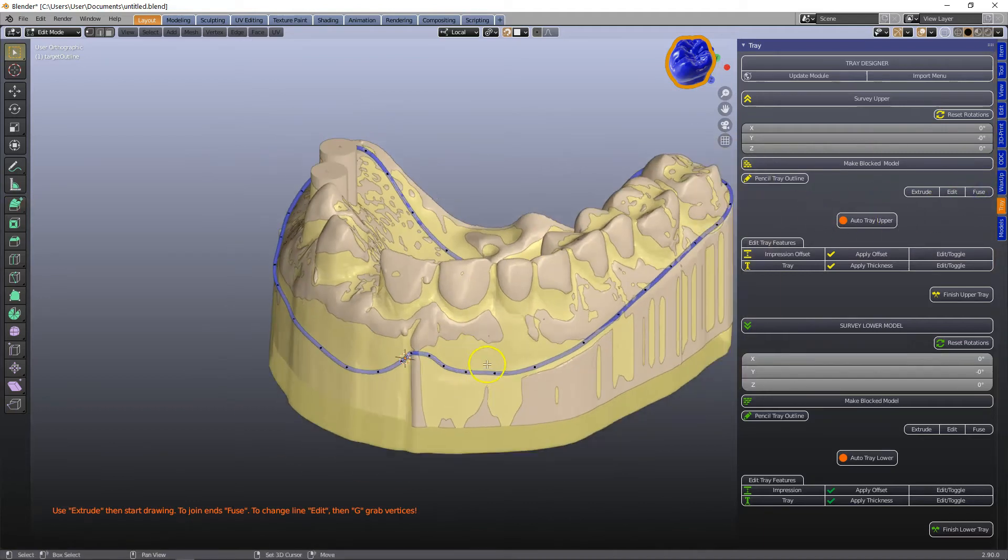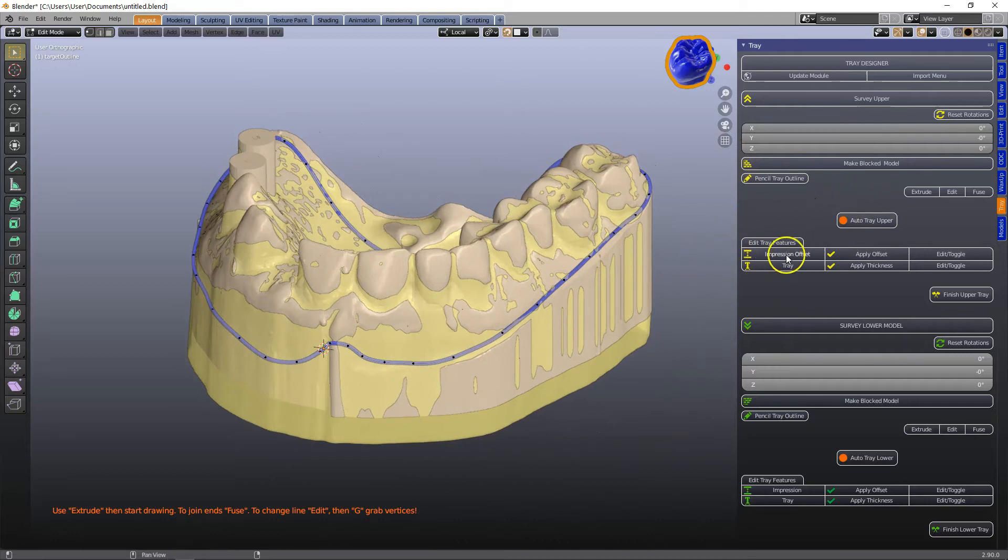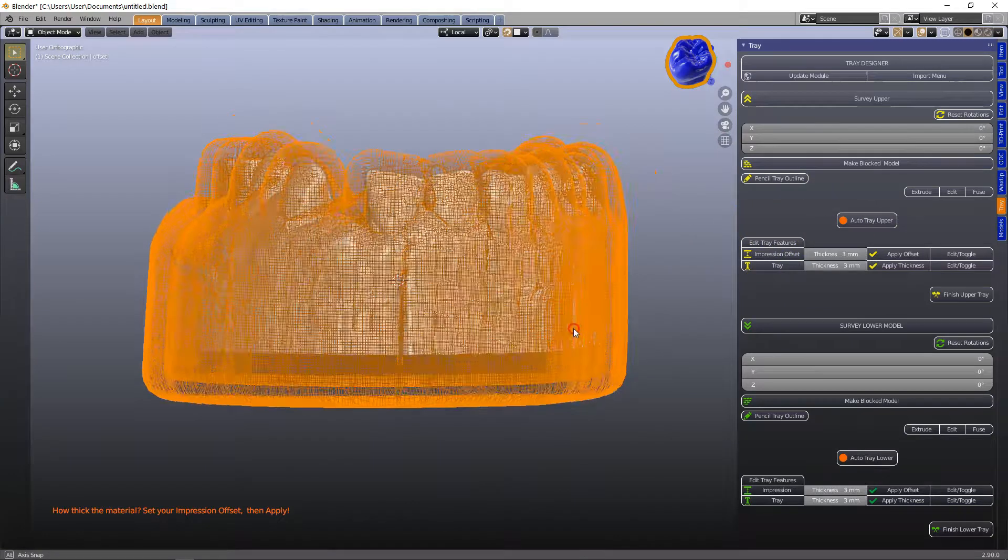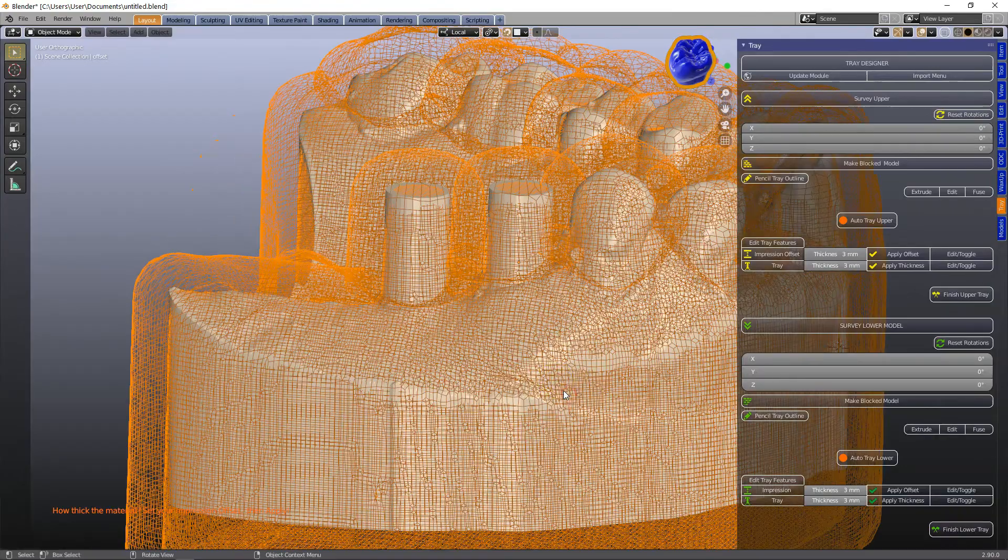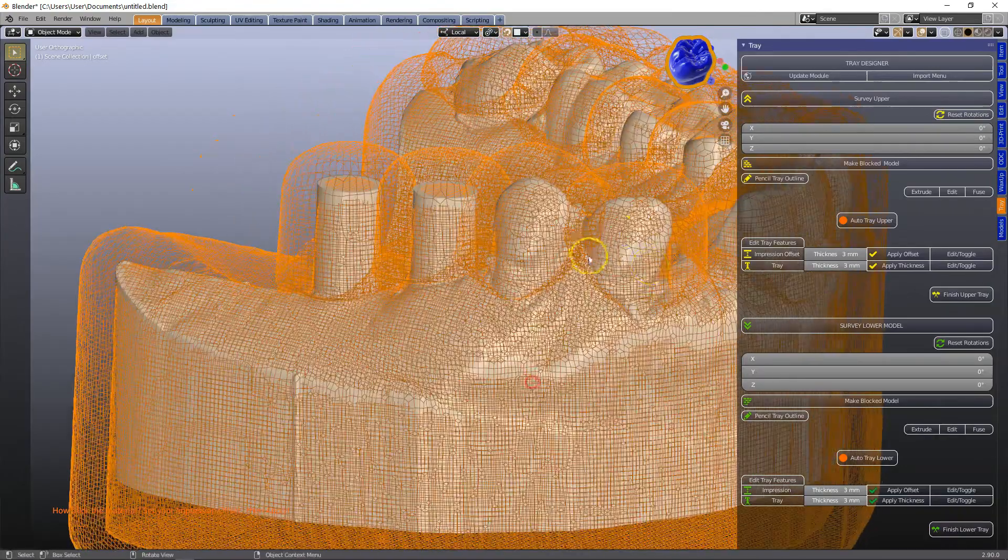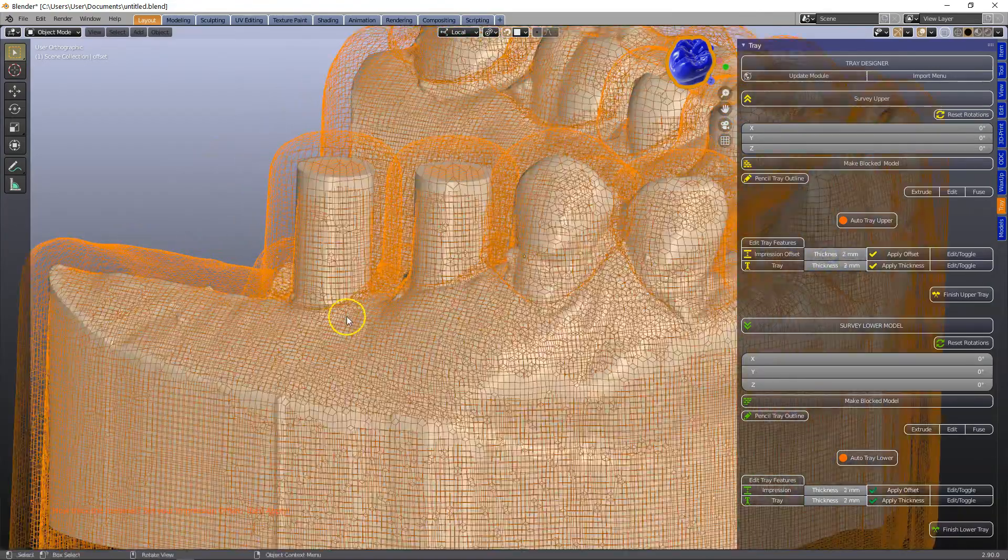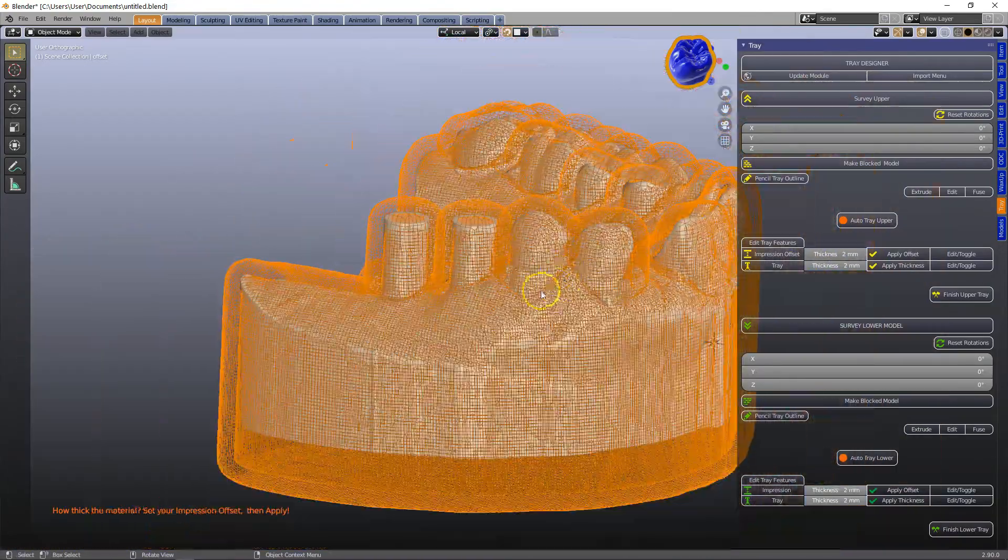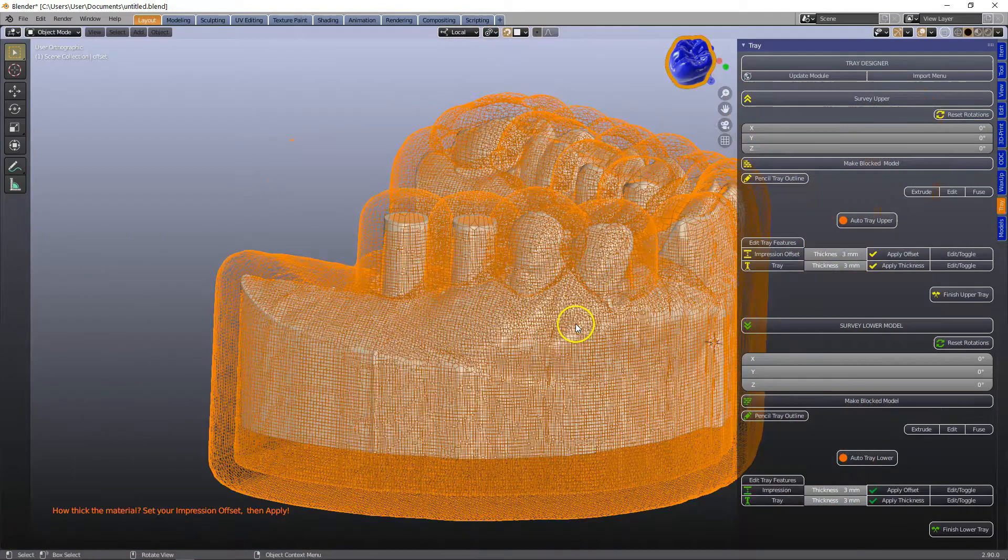Following that we can click on auto tray upper or in this case I'm going to show you how to do some cool stuff with the spacer. So this is our space layer we can set it to 2 or 3 millimeters depending how much material you want to use and then click apply.